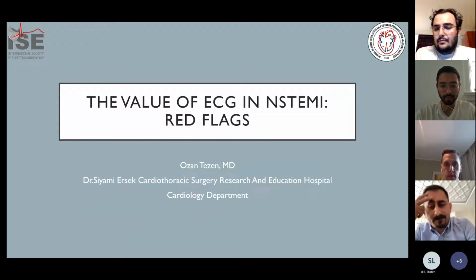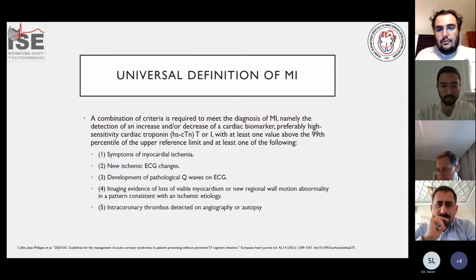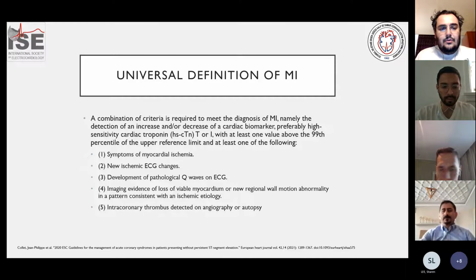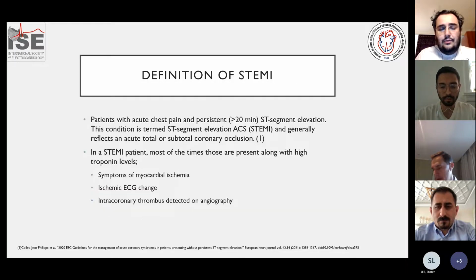Okay, I'm Ozan Tezen from Istanbul, Turkey. In this presentation, I will try to explain the value of ECG in non-ST segment elevated myocardial infarction. I will talk about red flags. First of all, we all know the definition of myocardial infarction, but very shortly, with a positive value of cardiac biomarker, one of these following symptoms, new ischemic ECG changes, development of pathological Q waves, imaging evidence, and evidence of intracoronary thrombus.